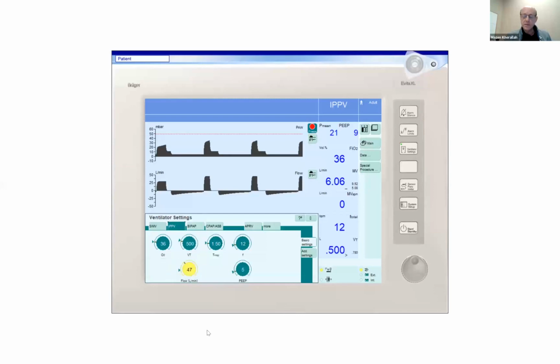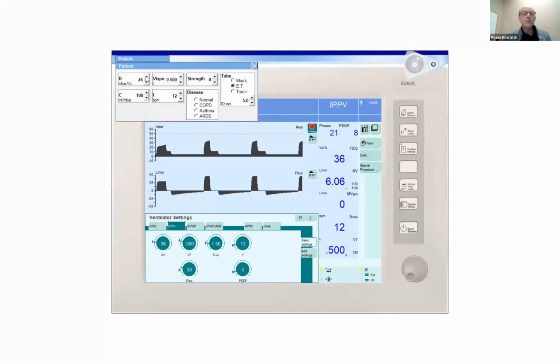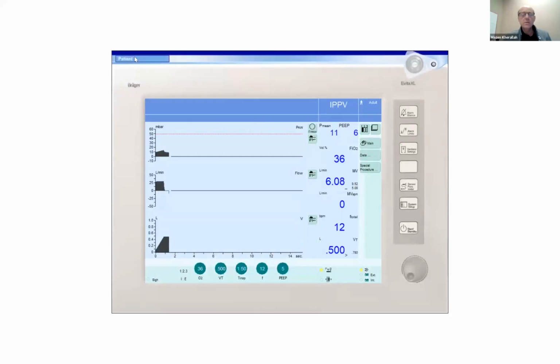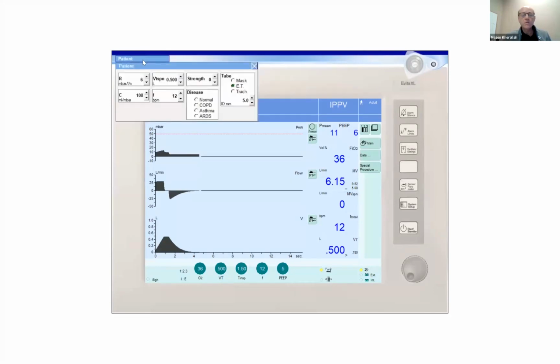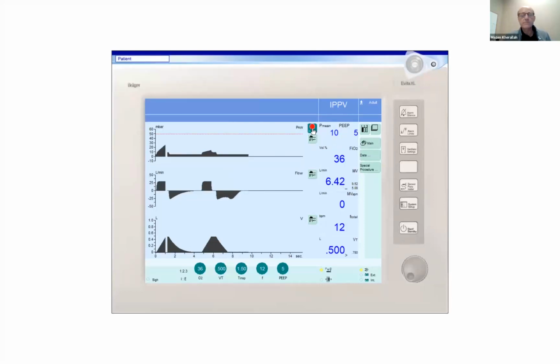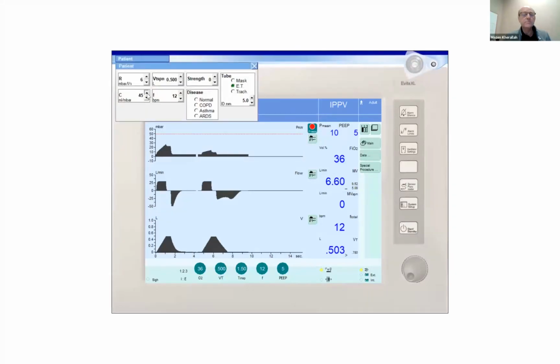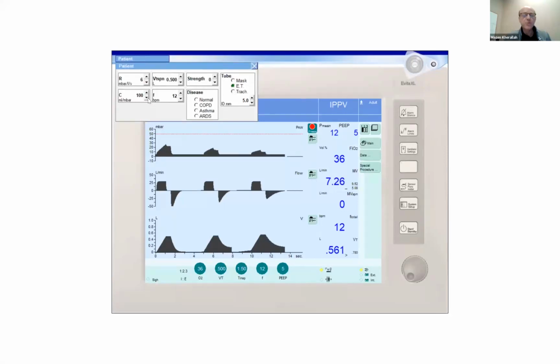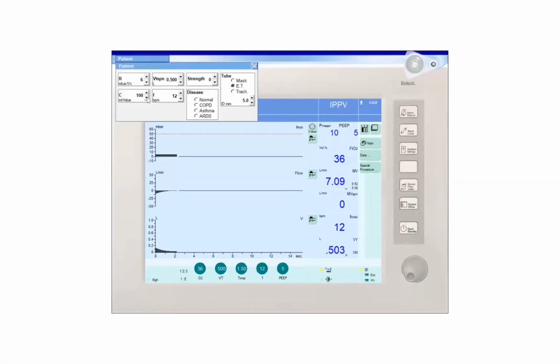Let's go back and correct this back to the baseline and improve the resistance. Okay, I need another volunteer, please. And now I'm going to change another variable. Okay, I'll get the first one, the second one, and then the third one. I'm sorry, I have to do it again. Okay, so I'm going to wait for the first breath. And then decrease.